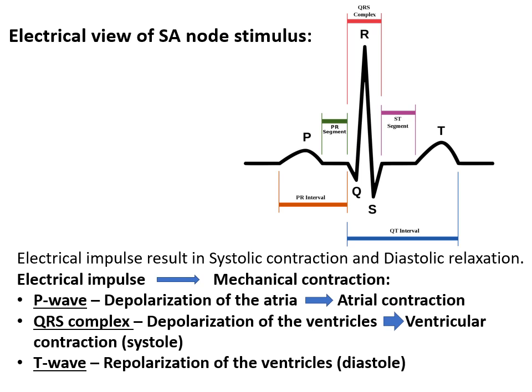And that will lead to ventricular systole, or a systolic muscular contraction. And then you get to an ST segment. So there's nothing, it's basically isoelectric. There's nothing happening. Followed by the T wave, which is repolarization of the ventricles.